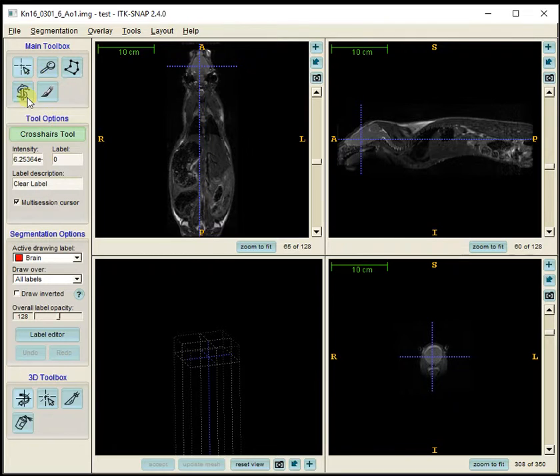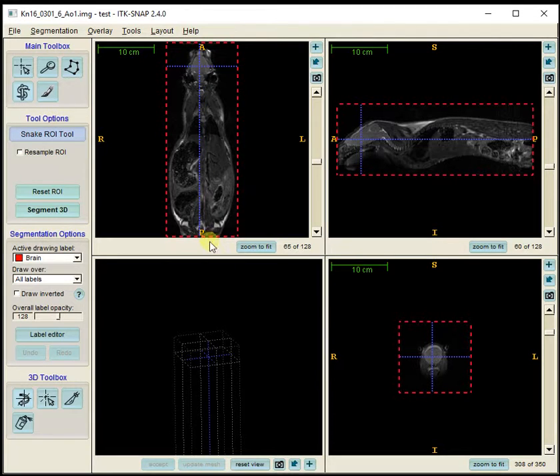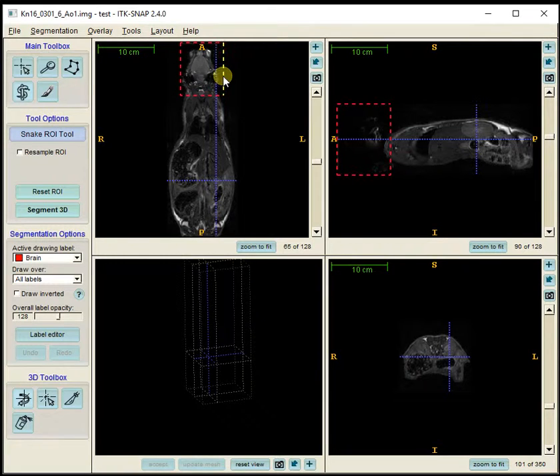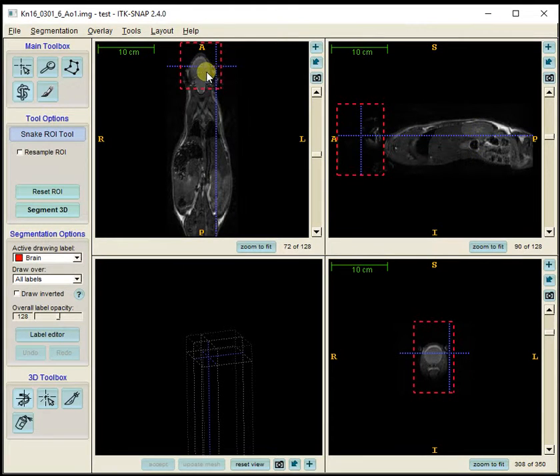I'm going to press the snake tool, which brings up an ROI that surrounds the entire image. I want to make this region much smaller to only focus on the brain, so I grab each side and bring it in to surround the brain only as much as possible. I've lost the sagittal view but I can just click here to get that back.